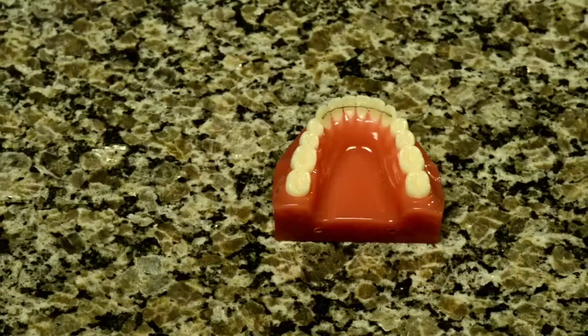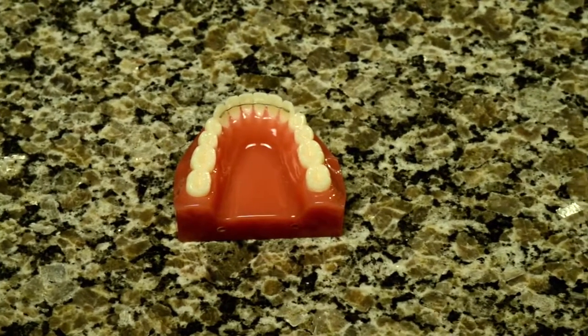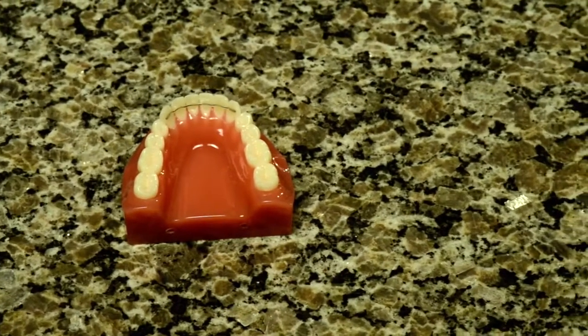Now that your teeth are perfectly straight, we need to keep them this way. We do this by using retainers. There are two types of retainers that we use. The first is a tiny wire glued or bonded behind your bottom 6 front teeth. We call this your bondable or permanent retainer.